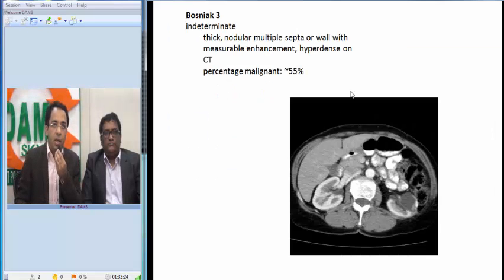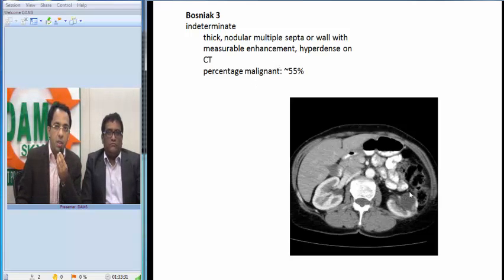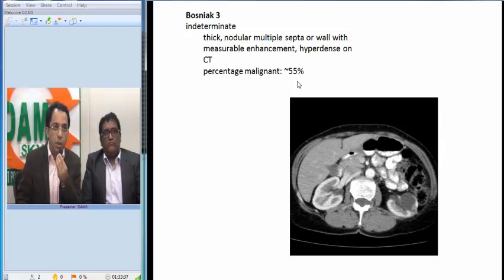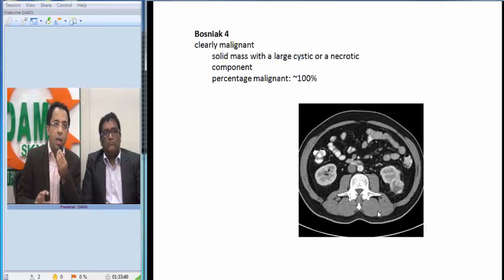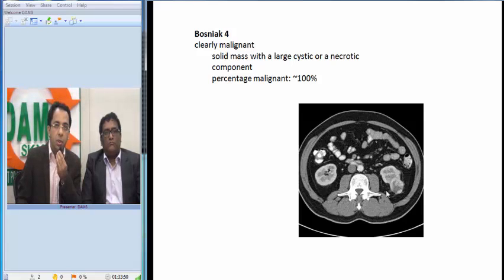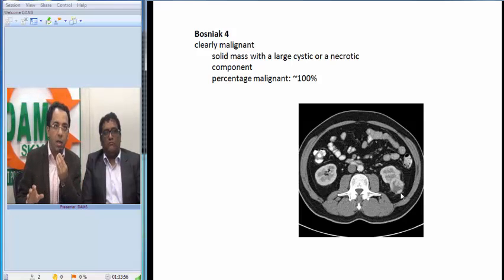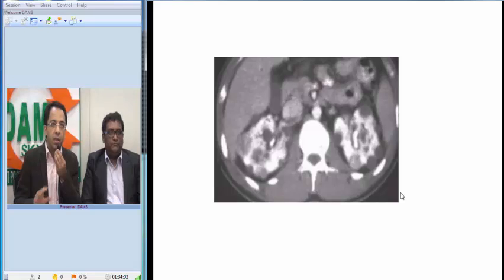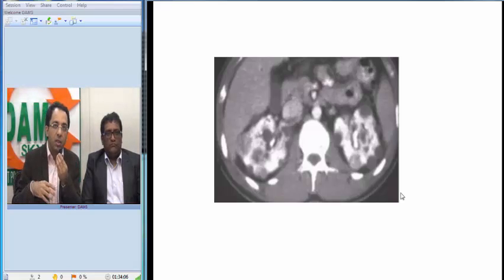Category 3 is when we see thick nodular septa or enhancement — for example, a nodule within the cyst showing enhancement. This carries a 55% malignant potential. Category 4 is a clearly malignant lesion: an exophytic mass from the kidney, solid, with thick irregular walls, necrotic center, and stranding in the surrounding fascia — looking definitely malignant. Looking back at our patient's case, we have a mixture of category 1 cysts and category 3 and 4 lesions.